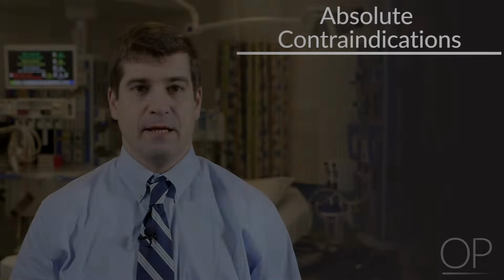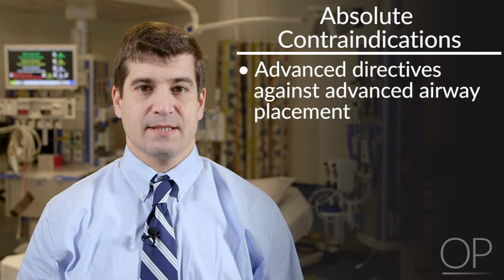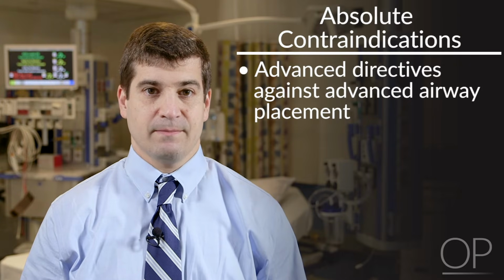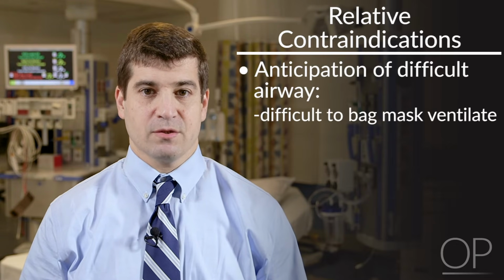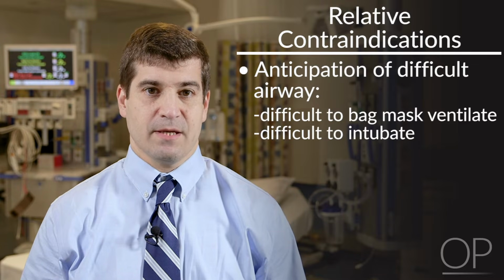Contraindications. In an emergency, there are no absolute contraindications to intubation except if the patient has an advanced directive against advanced airway placement. Relative contraindications to intubation include an anticipated difficult airway with concerns for difficulty either with bag mask ventilation or of successful intubation.